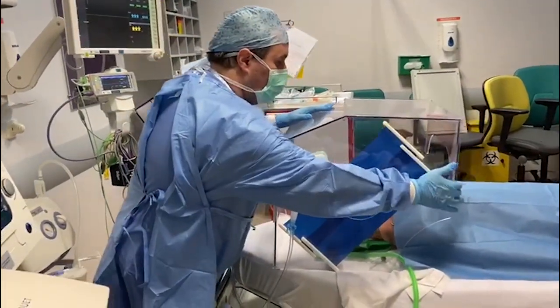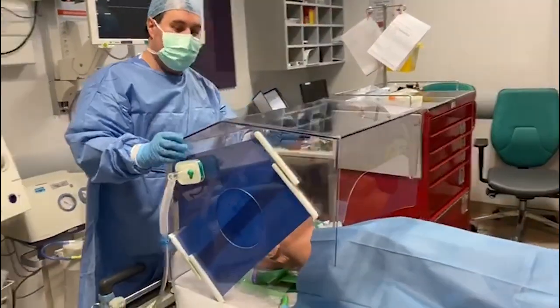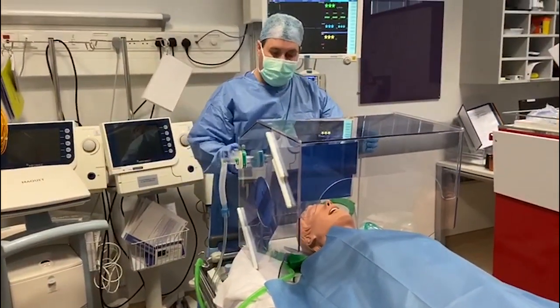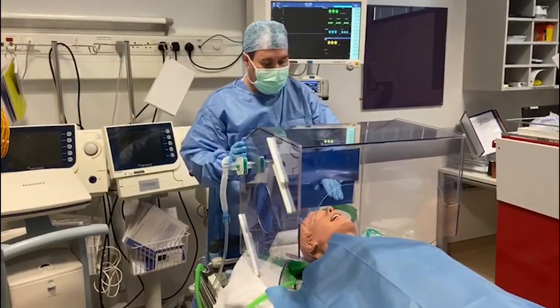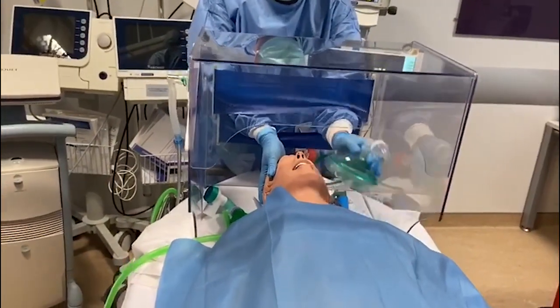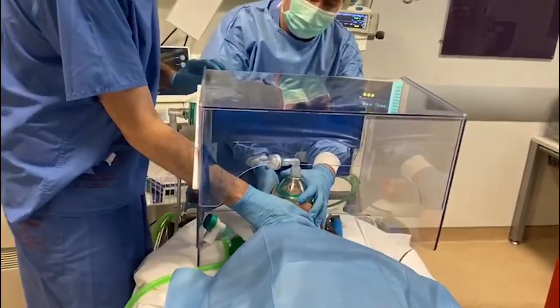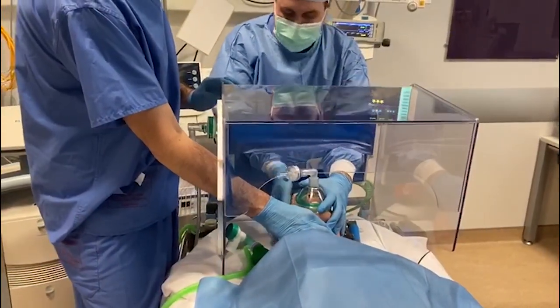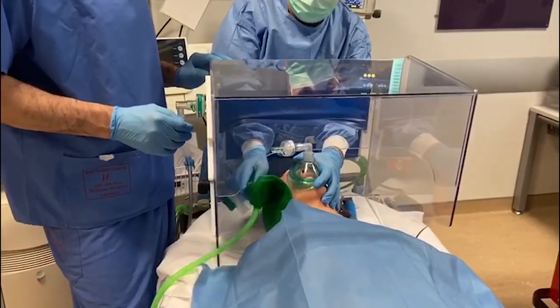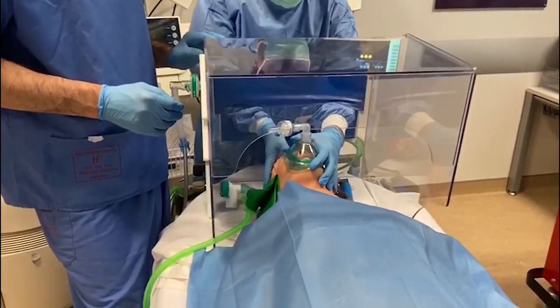During use, you can see a surgical drape over the tail end, just to help contain the aerosol dispersion. We've got plenty of room for manoeuvring. We can have our assistant do cricoid pressure, and we can even have instruments come in from the side or through the little gap allowed by the shoulder cut-outs.